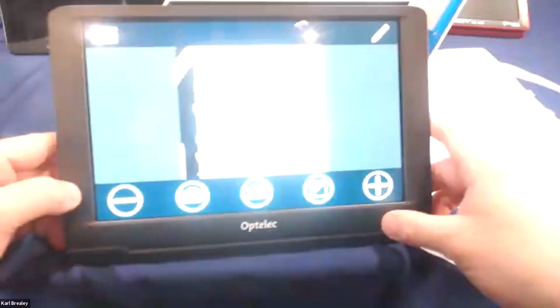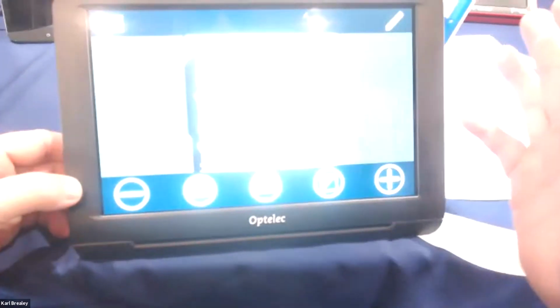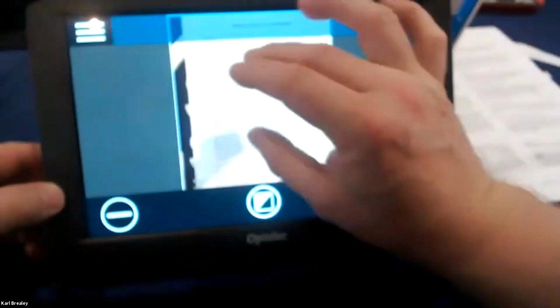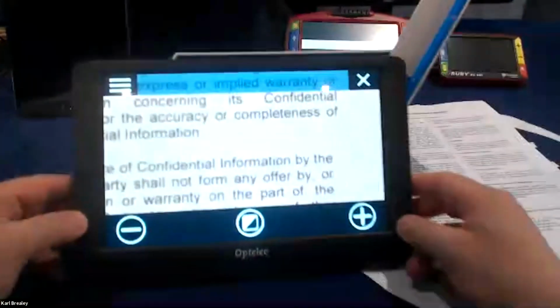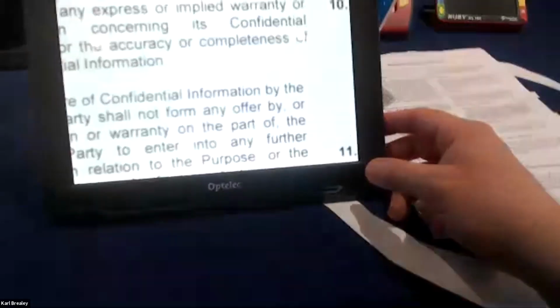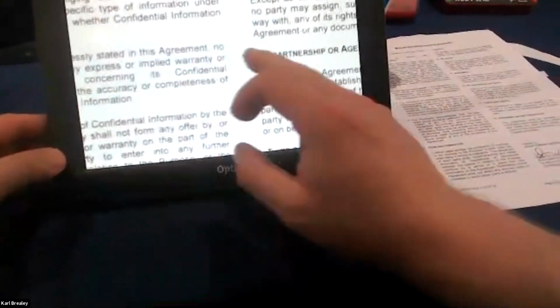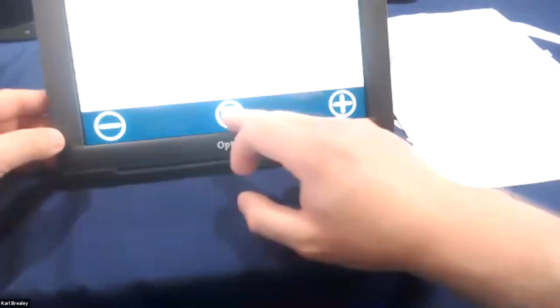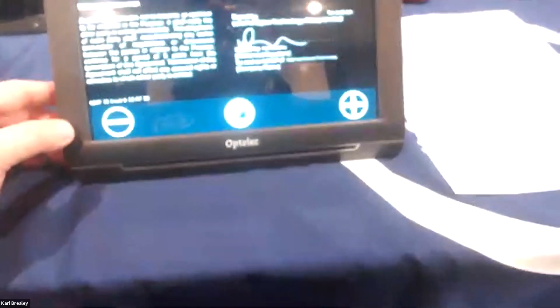And with its other ability as well, I can take a natural still of that image now. So you'll hear the camera go again. Getting a bit of a glare back again. But from that point now, I've captured that. That is a lot of glare. That just shows you how. There we go. So from that point now, I can control it. But the brilliant part is, I actually have the whole A4 document captured underneath that image. So I can scroll back and forwards between the whole document.